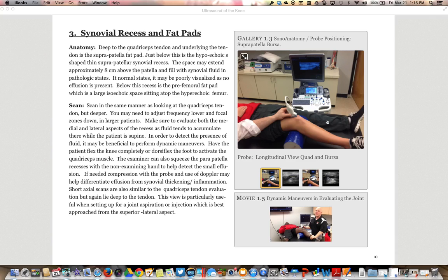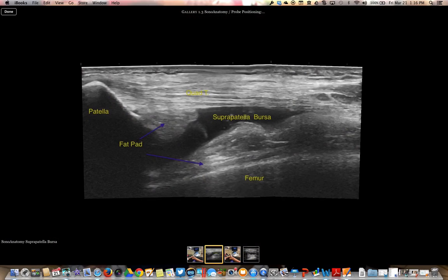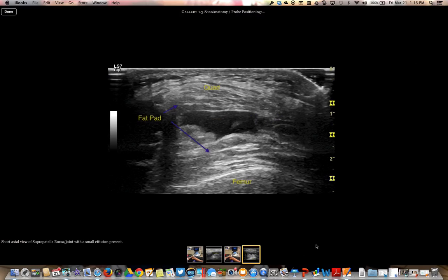Let's look at some of these views. Here's a view of the position, again, for the joint. Once again, our joint anatomy laterally, and again, our joint anatomy.